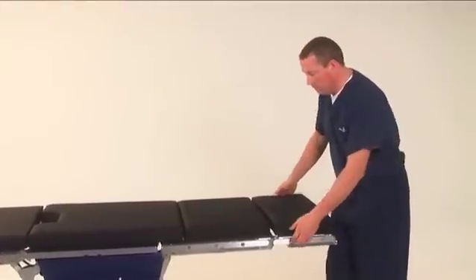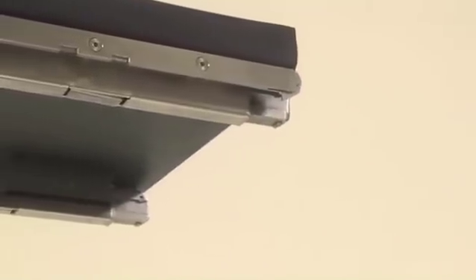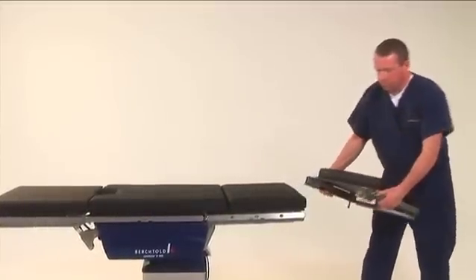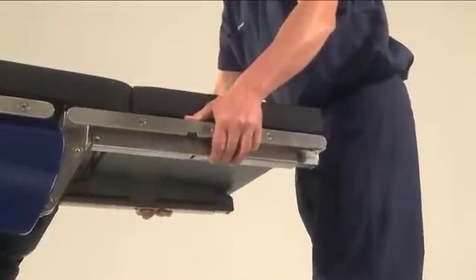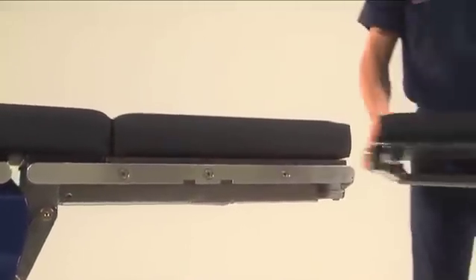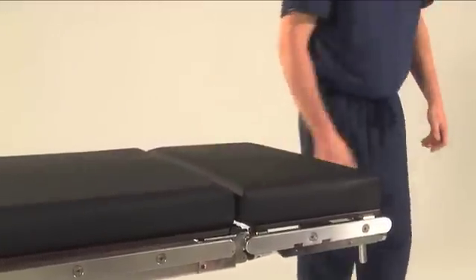To remove the head section, press the lock release buttons underneath the table at the juncture of the head and back section and pull the head section away from the table. To return the head section to the table, simply slide the attachment rails back into place until you hear the locks engage. The head section is now secured.